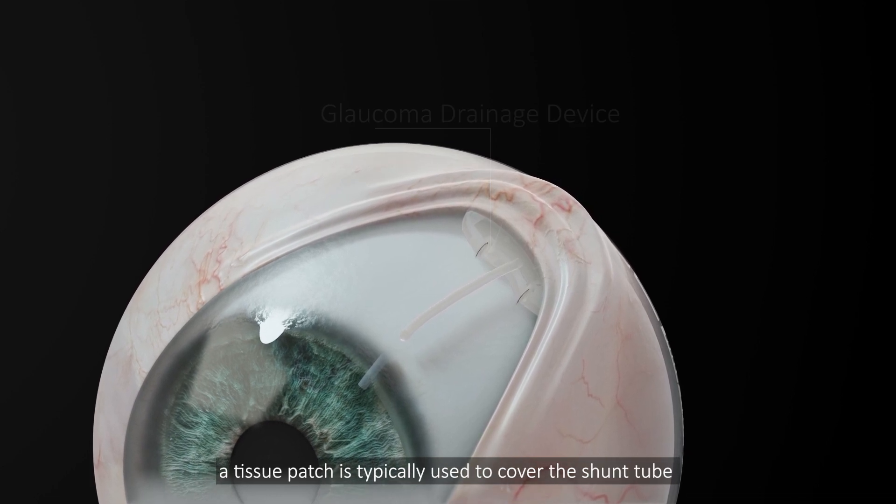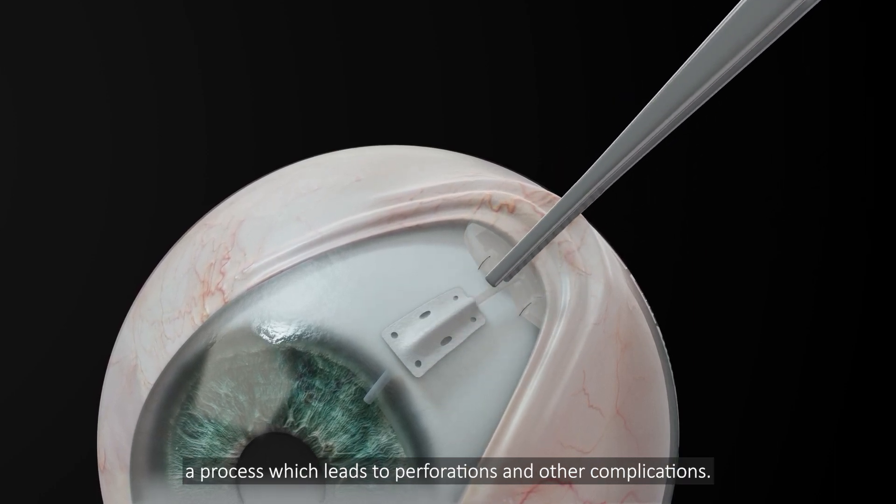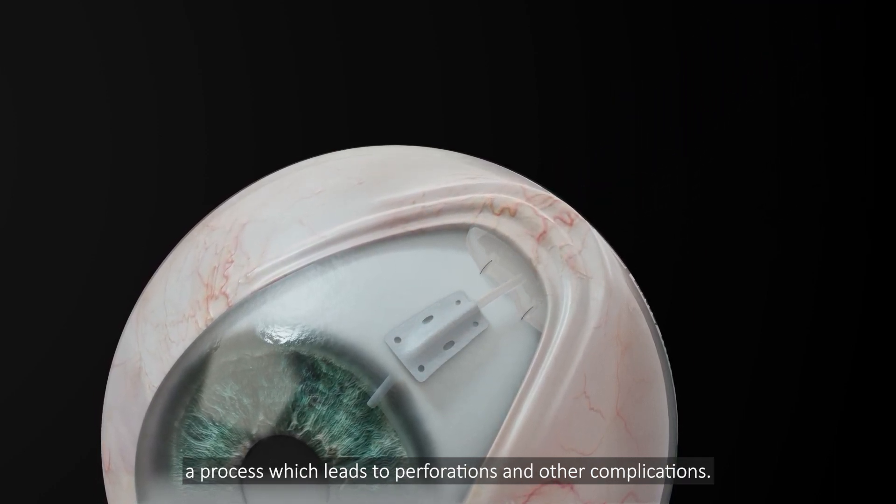In glaucoma shunt surgeries, a tissue patch is typically used to cover the shunt tube as a means of avoiding erosion of the conjunctiva, a process which leads to perforations and other complications.